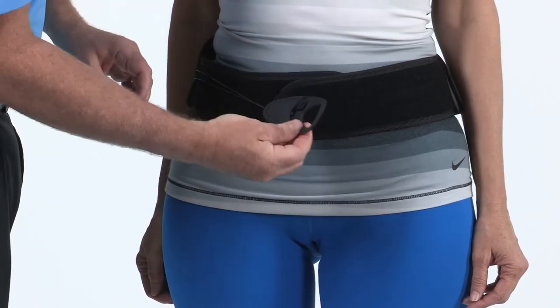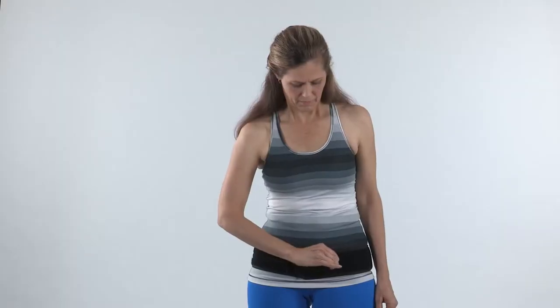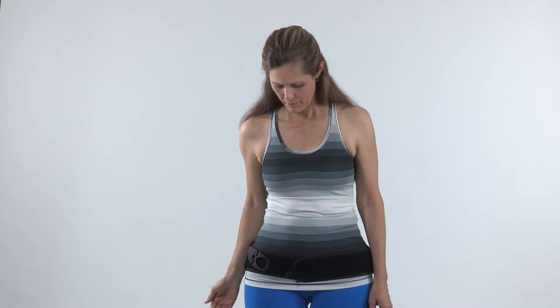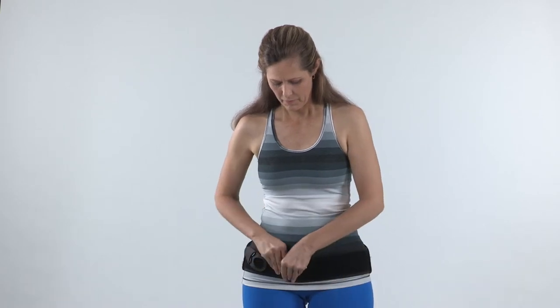To remove the brace, instruct the patient to remove the pull tab and reconnect the tab to the belt wing so there is some slack in the lace. Remove the hook attachment on the front of the brace by pulling on the release tab.